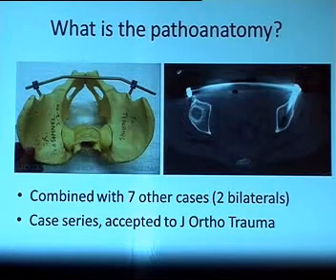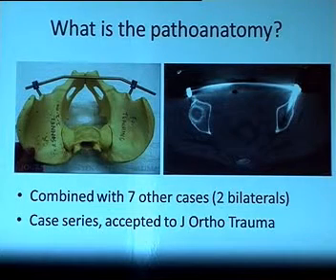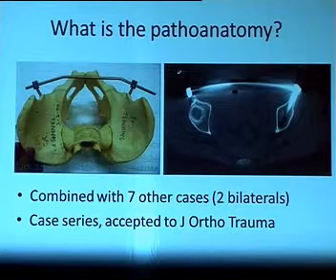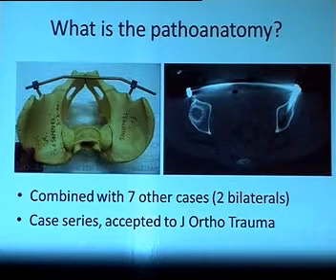And they've just come out with a paper now saying, okay, we need to put the screws with some buffer zone. So somewhere between 2 and 5 centimeters off the anterior inferior spine. So keep them proud and keep the bar from impinging on the fascia, which I think makes good sense.